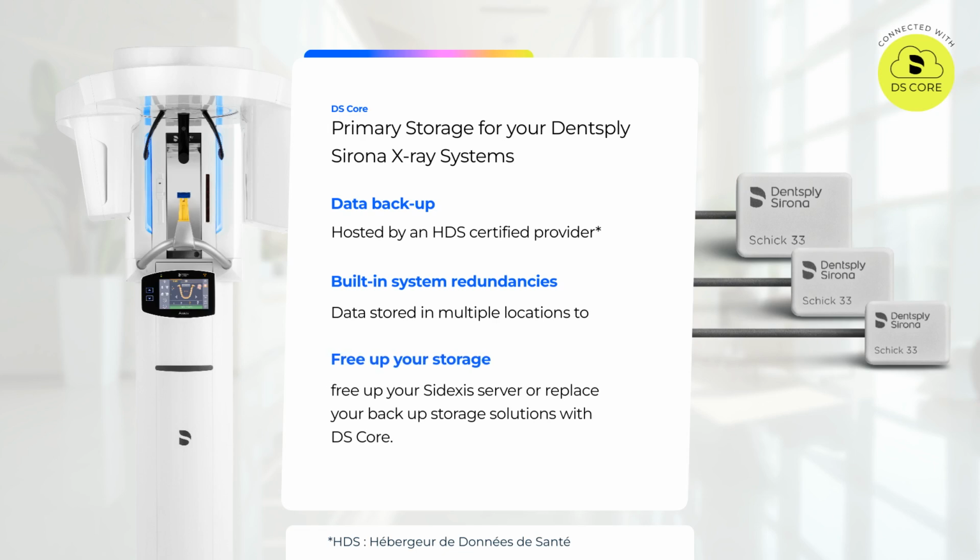You will be notified of this change as we roll out updated terms and conditions that reflect that Core can now be used as a primary storage. Primary storage for X-rays is available with a Core standard subscription.